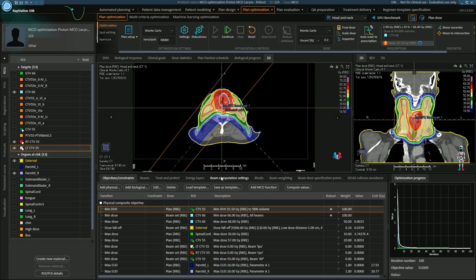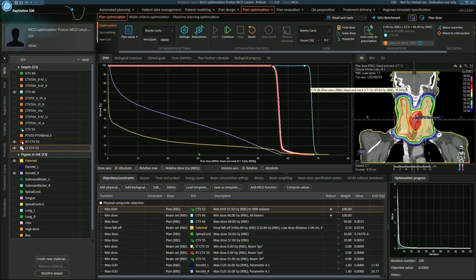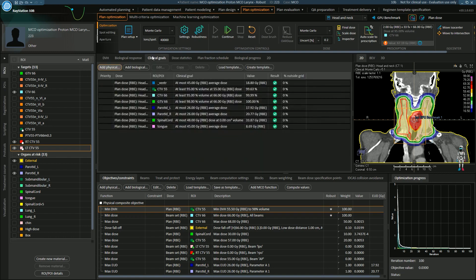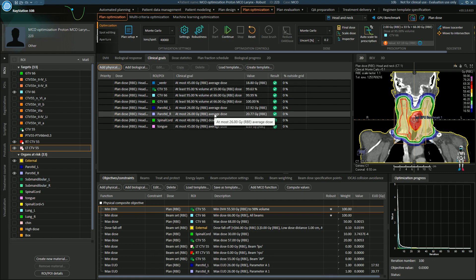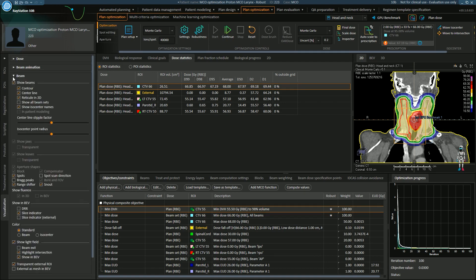Once we've optimized our plan, we would like to evaluate it. We can view the DVH for our targets and for our organs at risk. We can define clinical goals — these are the dose constraints that your doctor will give you for the targets and the organs at risk, and we can see quite clearly whether they have been fulfilled or if they have failed. We can also review dose statistics and review the Bragg peak for every single beam.